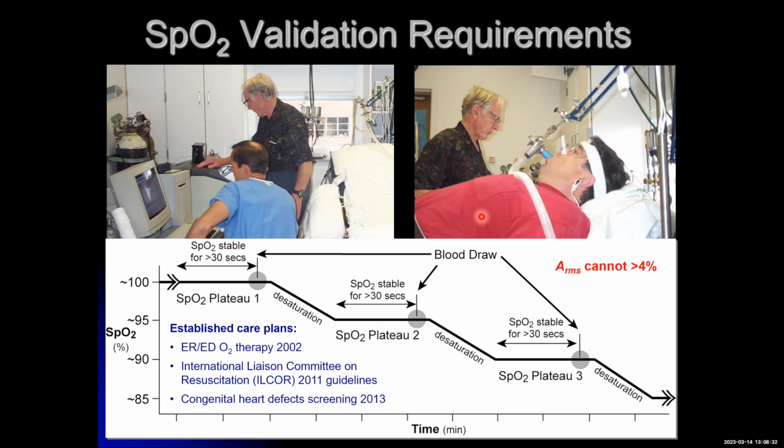Dr. Severinghaus managed his hypoxia study slightly differently than where it's being done now. He drove to very low saturation. To be honest, I had difficulty holding my bladder sphincter when I was down at 45%. So this is a challenging condition, but this is something that is required for manufacturers to meet.